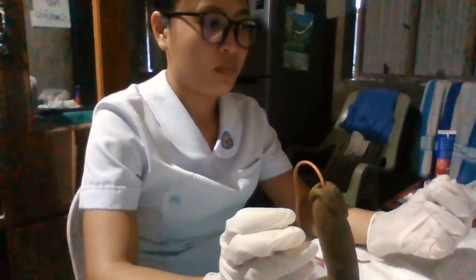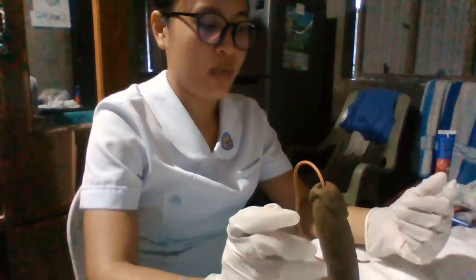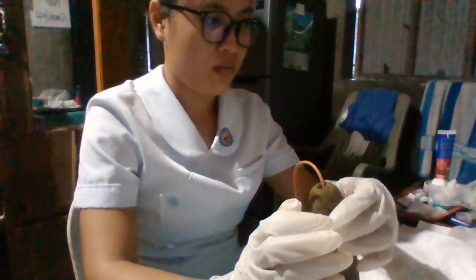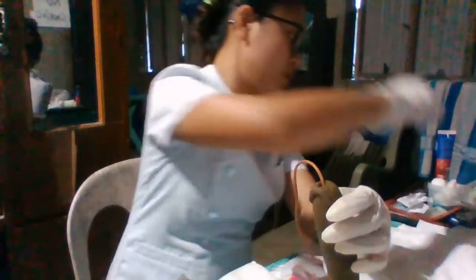After that, for a male client, while spreading the urethral meatus, we're going to cleanse around the catheter first.